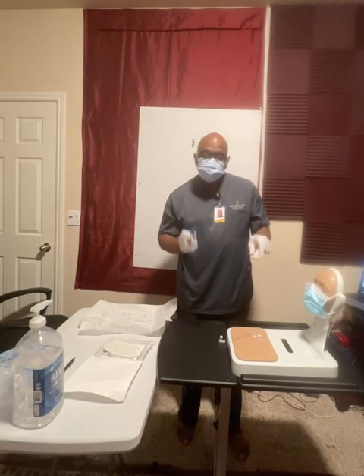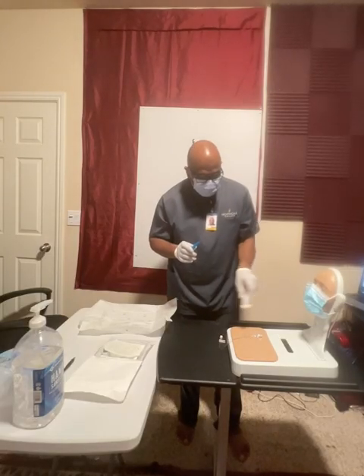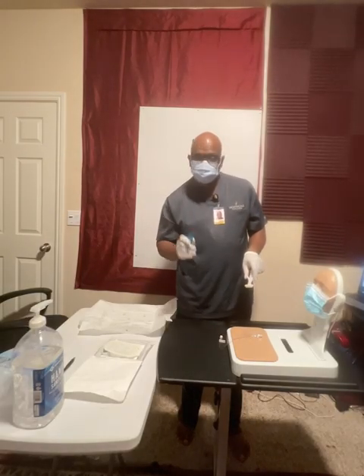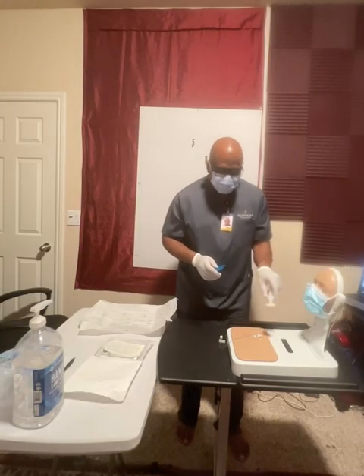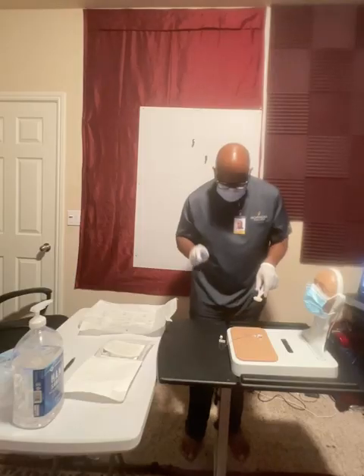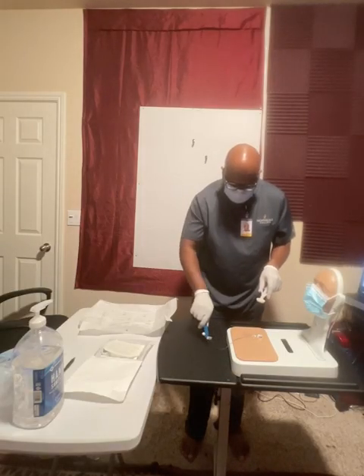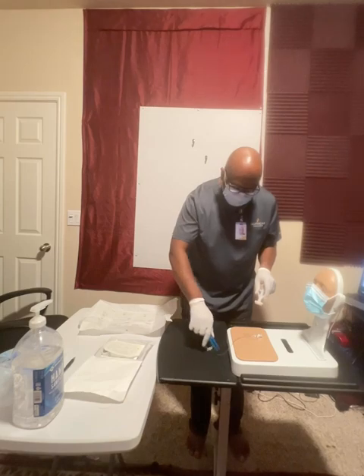With this device, the way we're going to clean is in a back and forth motion, right? But we want to create some friction with this device. So we're going to clean all four sides, back and forth, underneath, all that good stuff. And then with the forceps, I am going to grab the edge of the tubing.